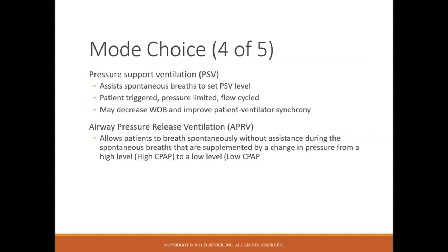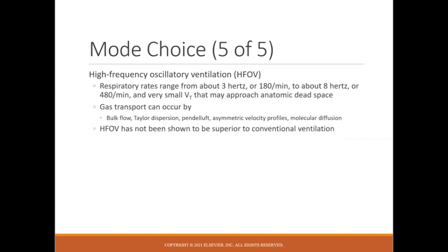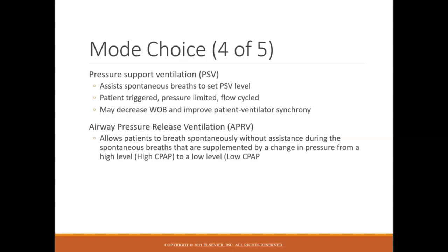Airway pressure release ventilation allows for that spontaneous breathing. So it's using those high and low pressures really as a recruitment technique. So APRV is very beneficial in patients that have poor lung compliance and poor oxygenation.